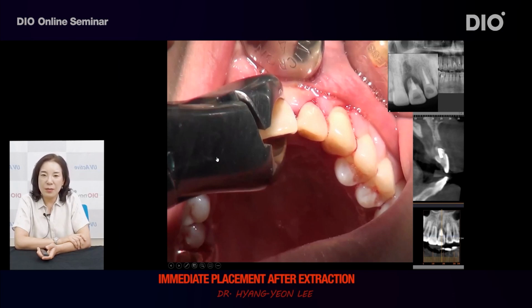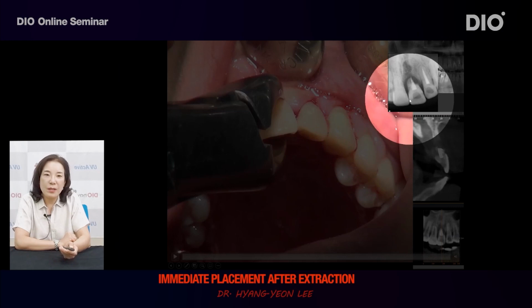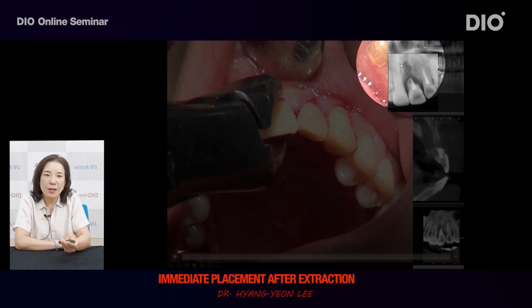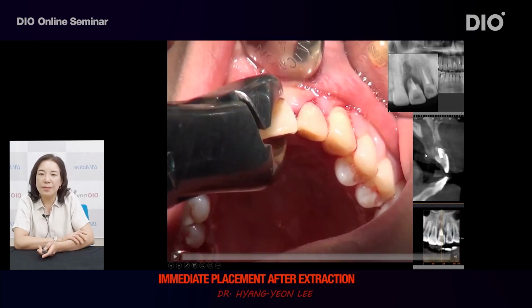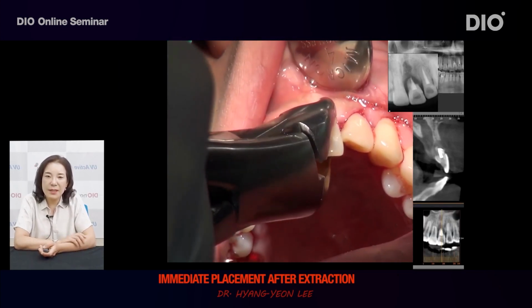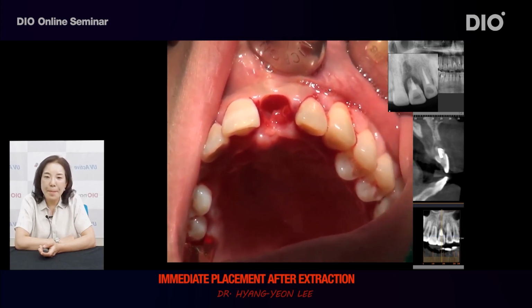Since it is not easy to show the image of removing inflammation for the molar tooth, I will show the video of that for anterior tooth. If you see this patient, there is extremely severe inflammation and the bone absorption has extended to the lower portion of tooth apex. It has dissolved extensively in the buccal side and bone remains only at the top of the gum with almost no bone at the bottom of the gum. Tooth is extracted.